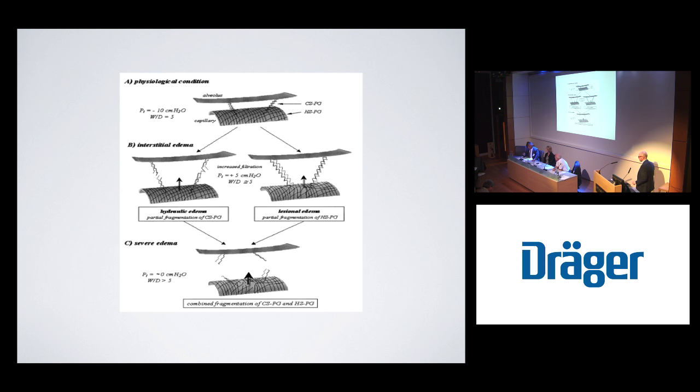And I think one of the key differences is the ventilation is done with a release phase rather than not really moving the lung entirely or just very briefly moving it. That may have something to do with the way water moves, it's possible. But probably I feel the most important concept is that APRV is really CPAP. A lot of times you can think of APRV as, let me take a normal inspiratory time and keep adding to it. And if you think that way, you think, oh, this is inverse ratio. Well, you can erase that and think of it as just CPAP. And now what you're going to do is just briefly interrupt it. It just feels different if you come from the CPAP way.